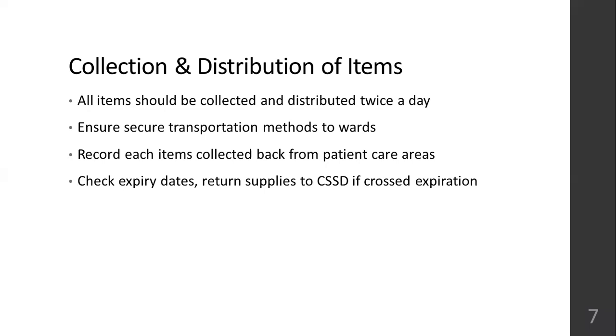Record each item that you have collected back from the patient care areas, so that you can ensure the control of the supplies. Okay, if anything is lost, anything is missing, a person who is accountable can be found out.